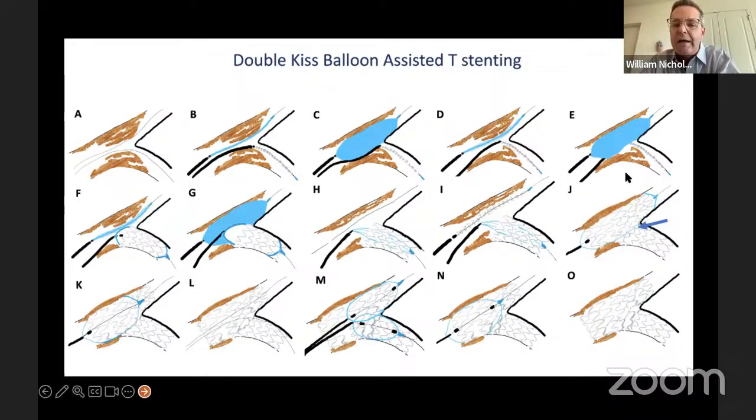The goal is to not have enough stent in here that you can mini crush it. The goal is to have it just barely protruding and then push that back up into the carina. And it's with the POT segment and the next kiss. So you'll POT, then we'll rewire the side branch, and then obviously we kiss. And when you kiss, it pushes this flap.